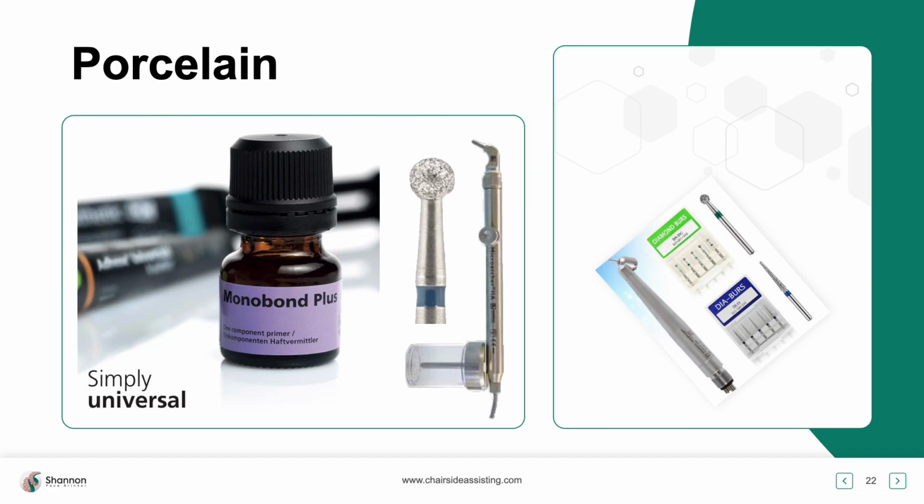One of the things we know about composite is it does wear, just like natural tooth structure, and we're putting a lot of pressure every time the patient is taking the aligners off and on. They are causing wear and tear. And again, going back to the more complex the case is, the more wear we'll see, and also the potential, when we're using these wimpy composites, of that attachment coming off.